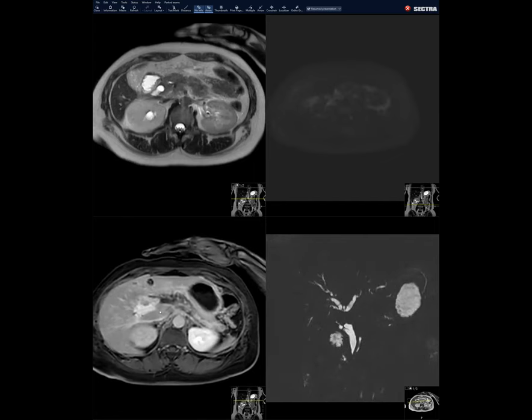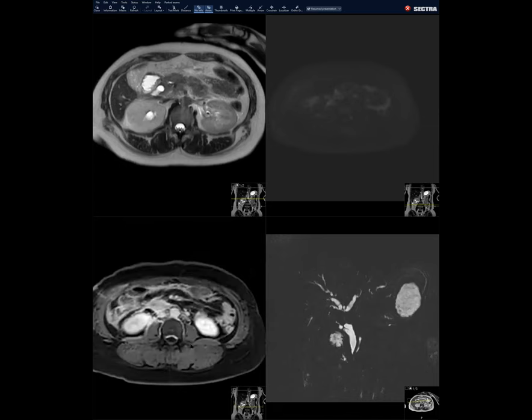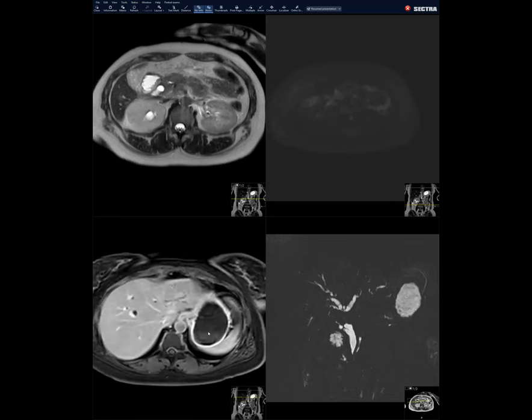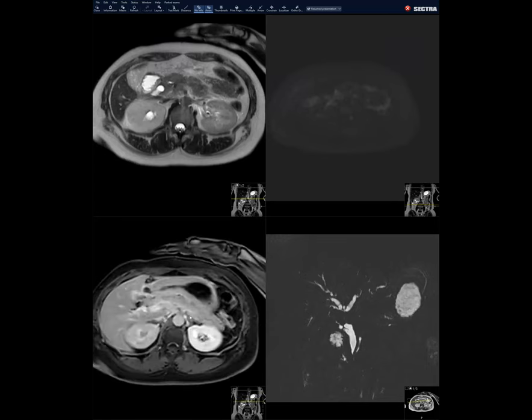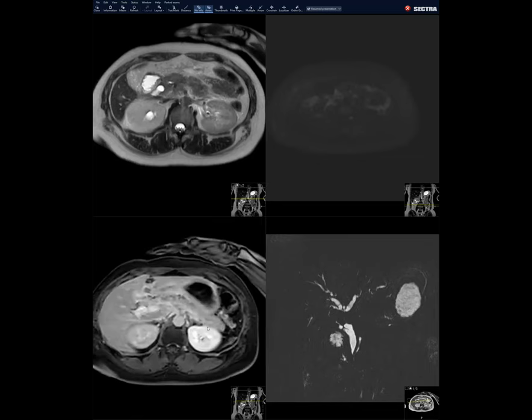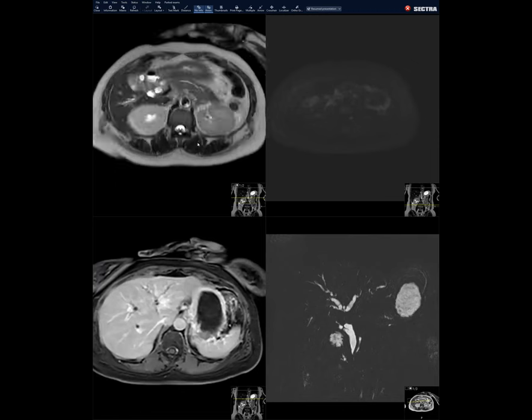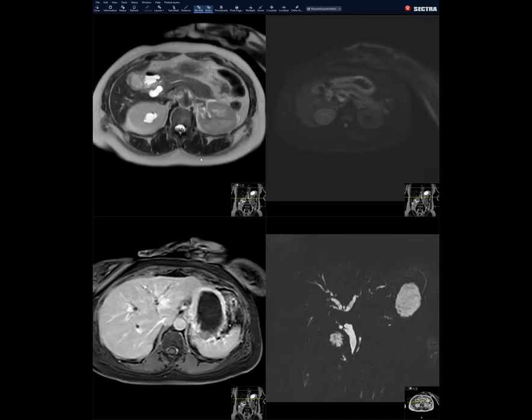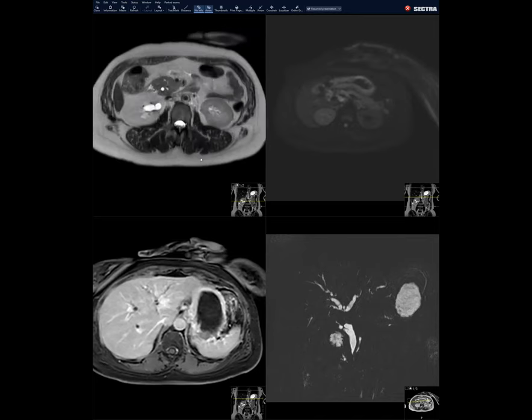These are delayed axial images showing the enhancing hilar mass. When we suggested the stomach was probably infiltrated by tumor, at first they were not sure, so they did an endoscopy and biopsy — that came back negative, showing only H. pylori and non-specific inflammation. We discussed the case again with the GI team and said we really think this is an infiltrative tumor given the way it restricts and the way the fold pattern is lost. So they went back and did a full-thickness punch biopsy of the stomach wall, and that came back malignant.